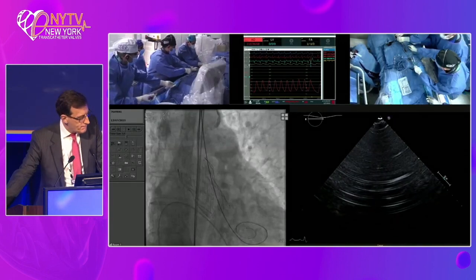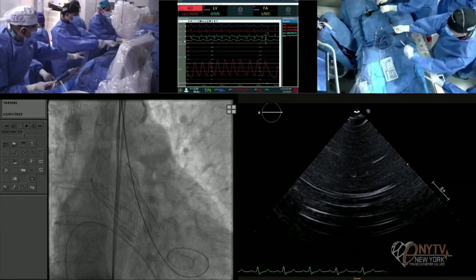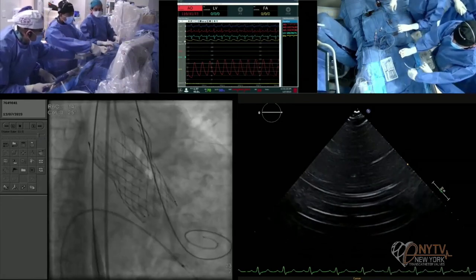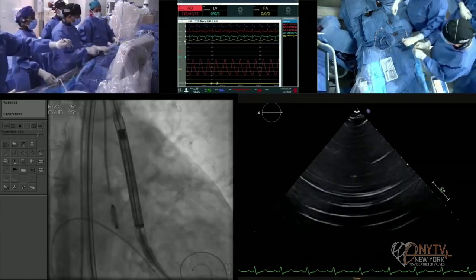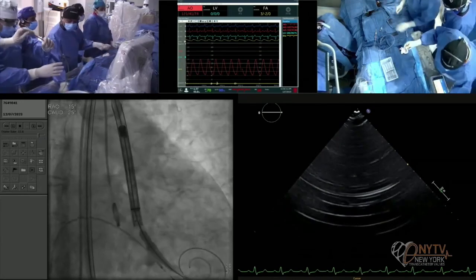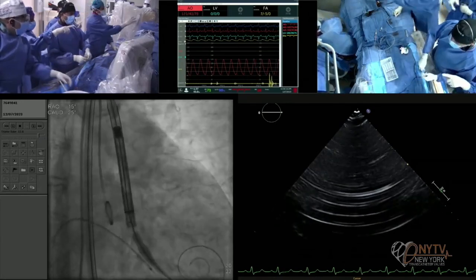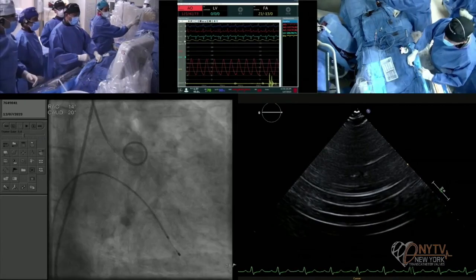So you can see the head marker should be facing you with the cusp overlap view. That's always been, it's like Evolut PRO+, but FX is now easier to do. And if your head marker is on the inner curve of the descending aorta before you go to cross the arch, you need to rotate it to the outer curve to maintain that. The key is to try to get the dots, and we'll show that. Hafiz, show the echo.